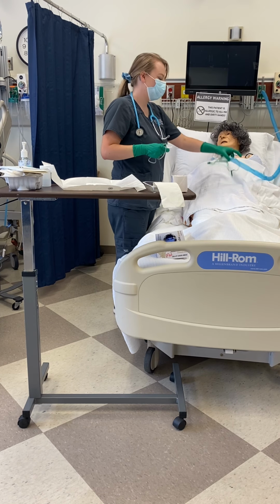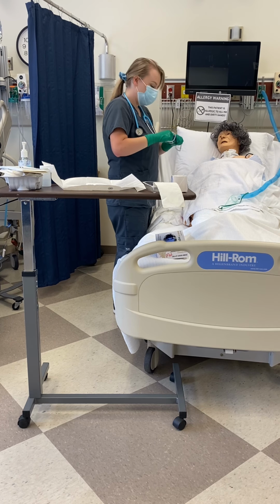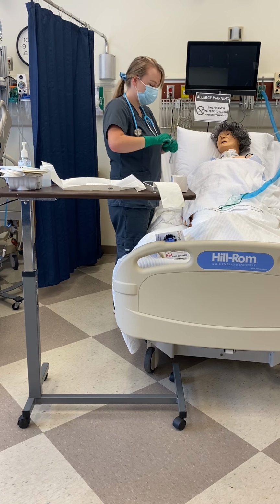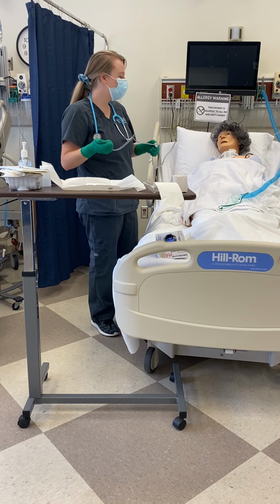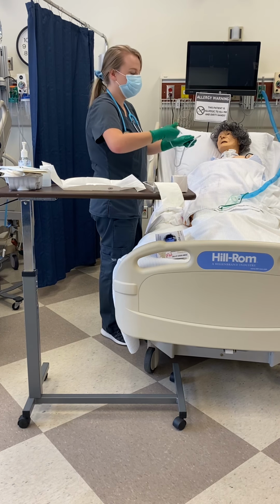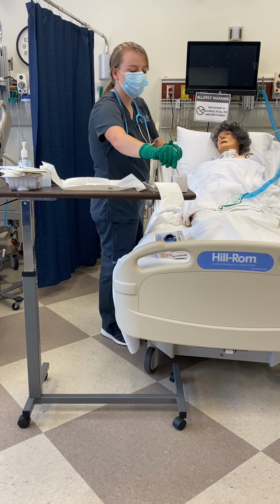Alright, and now I will take the oxygen off, and this hand is no longer sterile, and I will connect it to the suction and make sure that the suction is working. Alright, so first I'll get it wet, make sure the suction works.